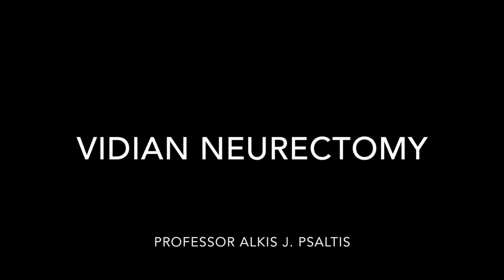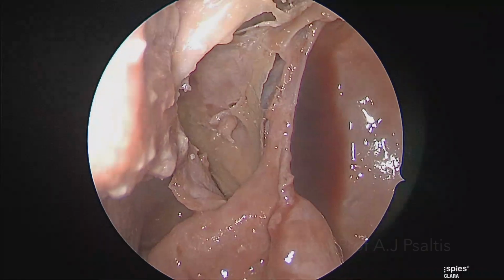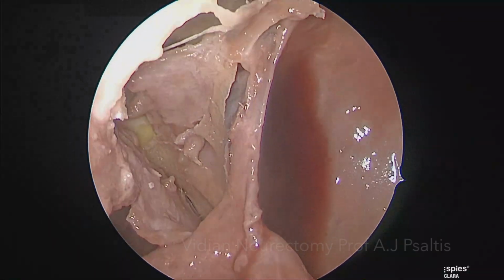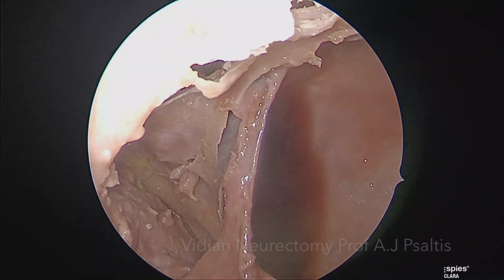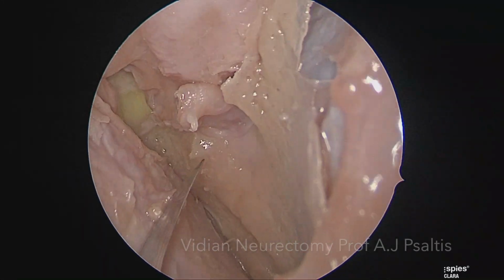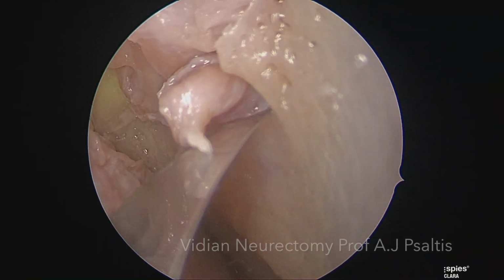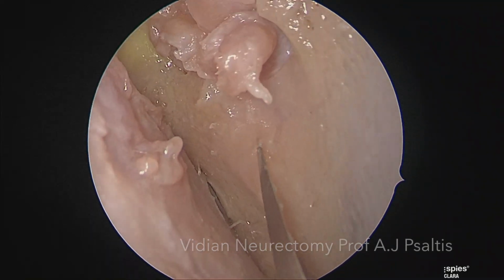We will now demonstrate the Vidian Neurectomy. The Vidian Neurectomy begins by identifying and ligating the sphenopalatine artery, as this structure lies anterior to the Vidian nerve and needs to be sacrificed in order to gain access to the Vidian canal.